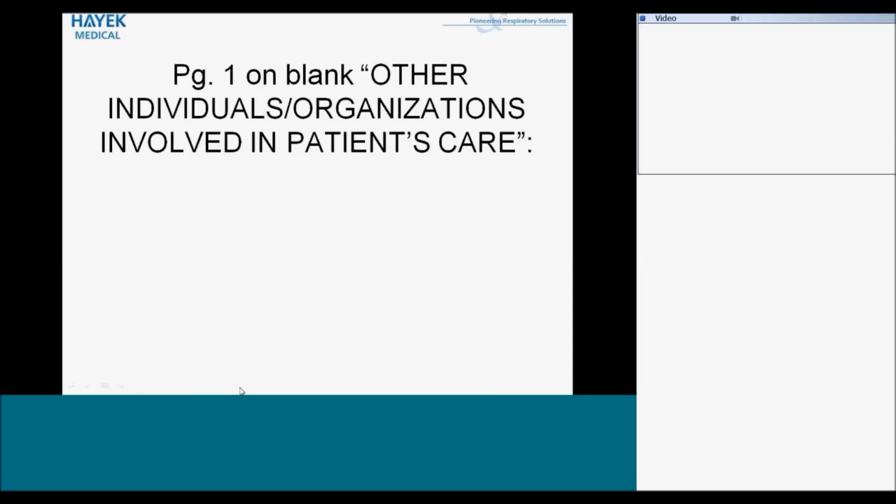But actually in the patient's bedroom, I believe there were grounded outlets, but we wanted it backed up. And then we initiate a patient assessment, including sleep habits, mental evaluation, some vital signs, height and weight, breath sounds, secretions if present, pulse oximetry, and other pertinent findings.